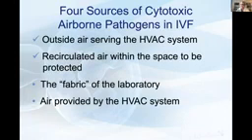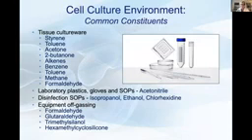Relative to within the laboratory, Jacques referred to this, and he's correct. There can be a number of very significant sources of VOCs within the IVF space itself, many of which are very difficult to avoid. I'm sure all of you on this webinar have opened up a sterile sleeve of tissue culture ware and smelled the styrenes and toluenes. That's obviously parts per million, if you're able to smell that, thus the reason for the off-gassing. Disinfection SOPs, your equipment's going to off-gas.